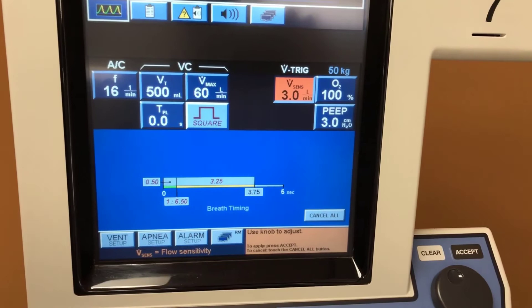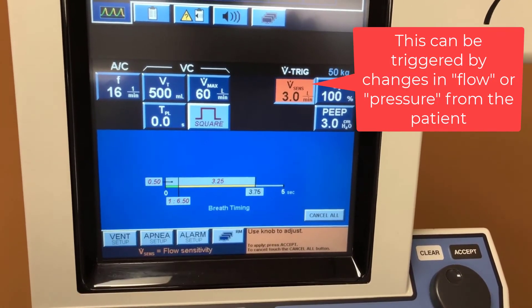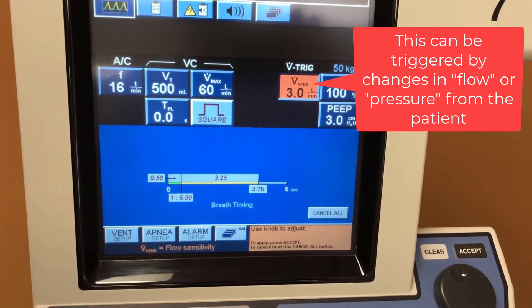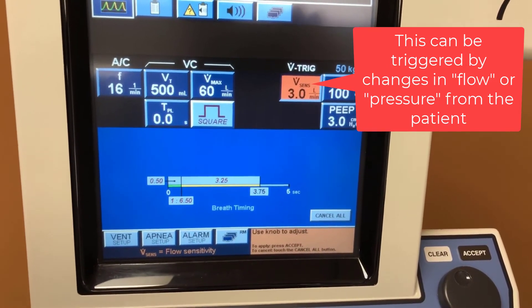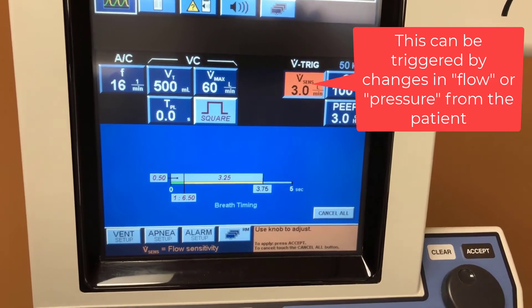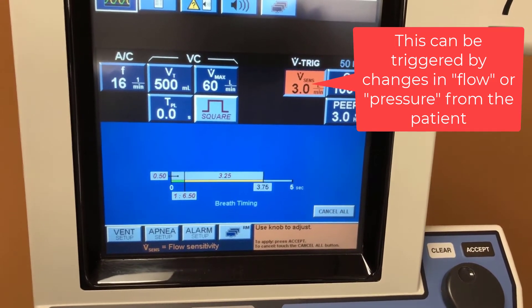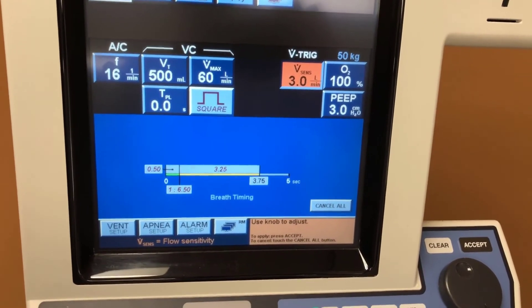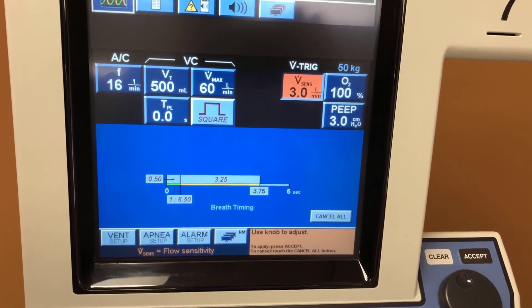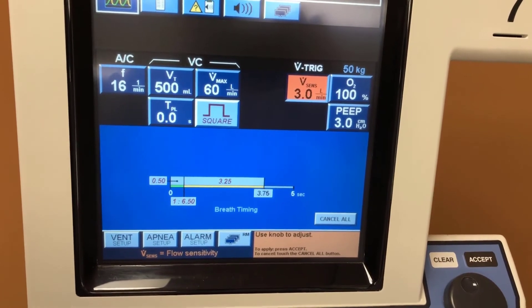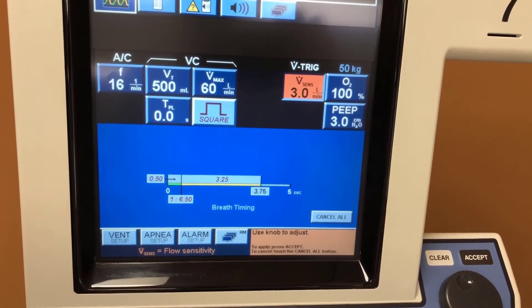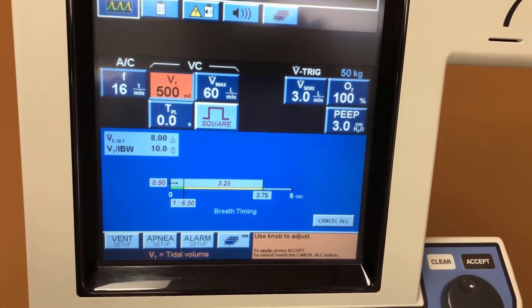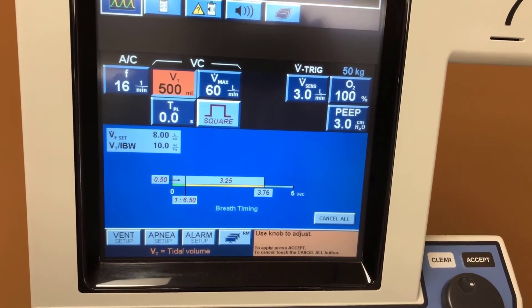The first number over here is V-dot sens, which is the flow sensitivity trigger. When the machine senses that the patient is able to generate three liters per minute of flow on his own, it takes that as the patient trying to take a breath on his own, and it will immediately generate 500 milliliters of air into the patient as a result.